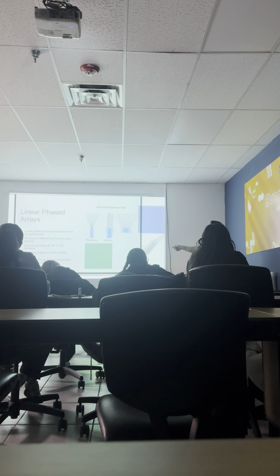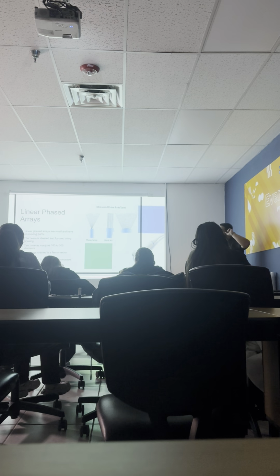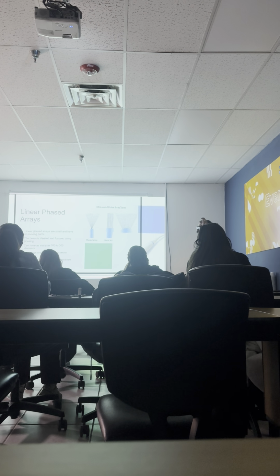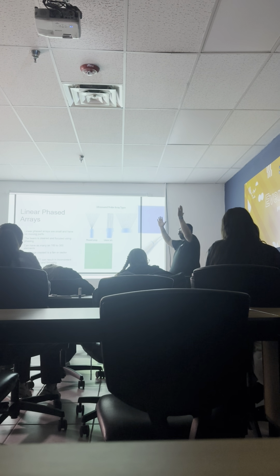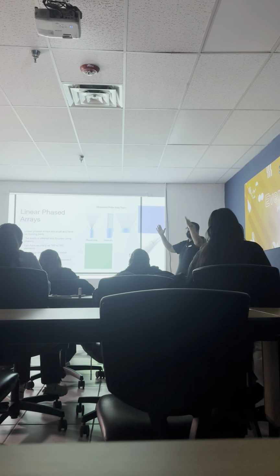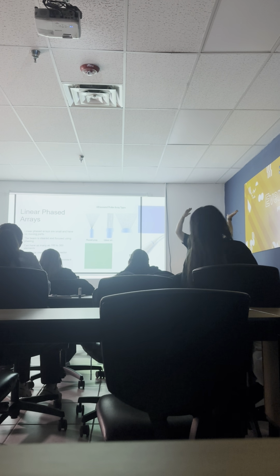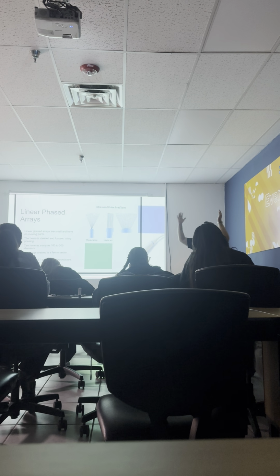So if you notice this right here, phased arrays, it's able to create that shape because, like was said, there is a sequence in which those crystals are initiated or fired. If we start from this side to this side, that's going to make our sound beam steer this way. And if we steer it from this side to this side, it's going to steer the opposite direction. So that's how it's able to get that image, by electronic steering or by phasing.